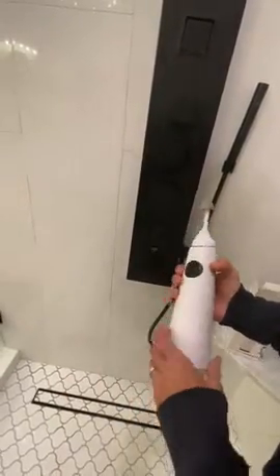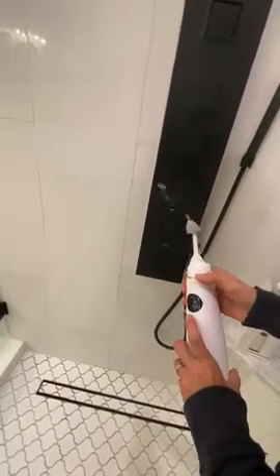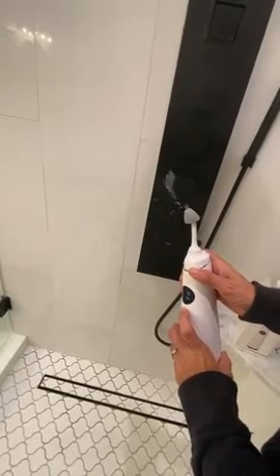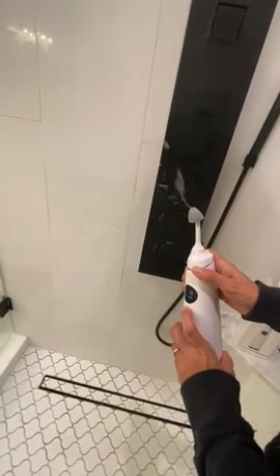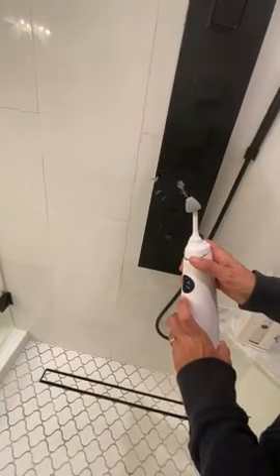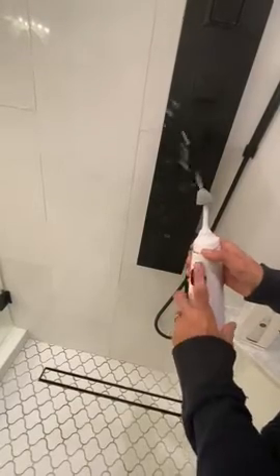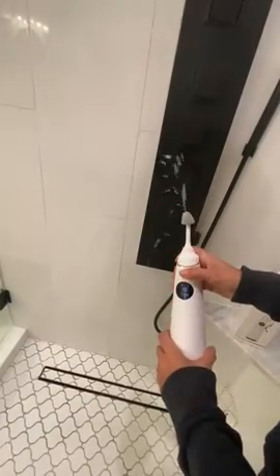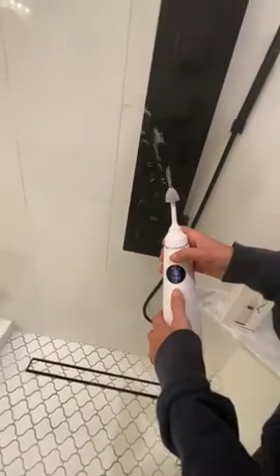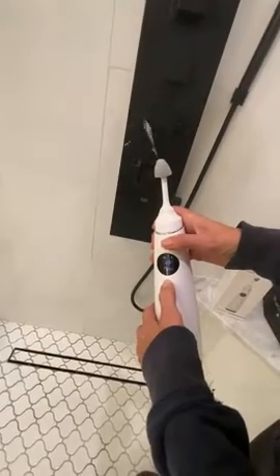Once it's filled up, you turn it on and it has different modes. It's got a very nice display, and you can see on the display what each mode looks like — that one is soft.